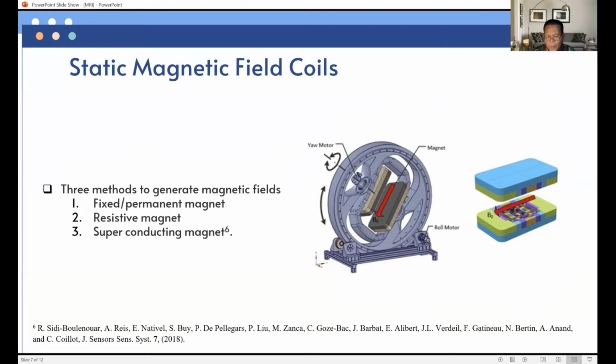The initial purchase price and operating costs are low compared to a superconductive magnet. This magnet can also be made with a lighter-weight rare earth metal such as neodymium, markedly reducing the weight of the magnet, but at significant additional cost.